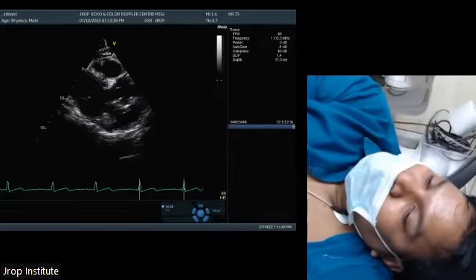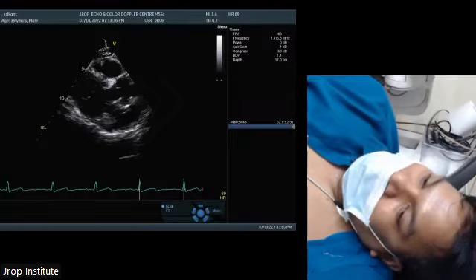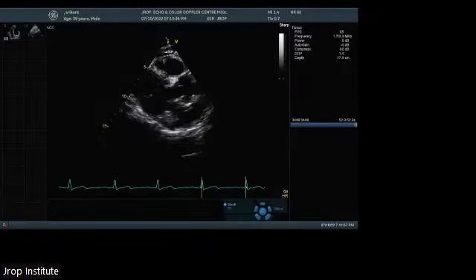Niharika. Go ahead, Niharika. Dr. Shadab. Sir, good evening, sir. Sir, can you explain once again, at parasternal short axis, how you are moving the probe to see the aortic valve level? It's very simple. Just look at the subject. In the focus.